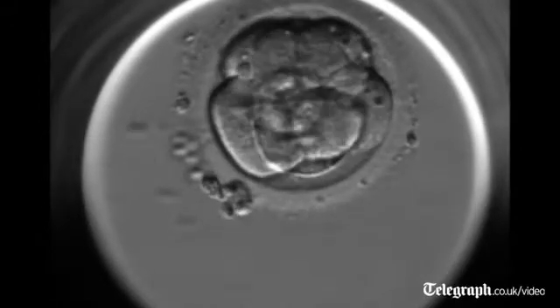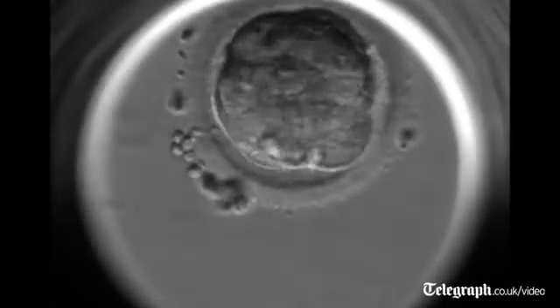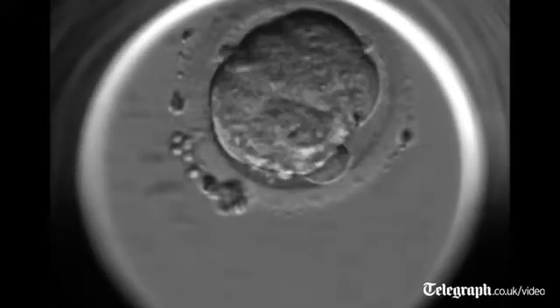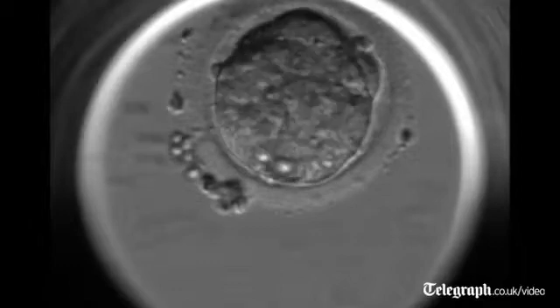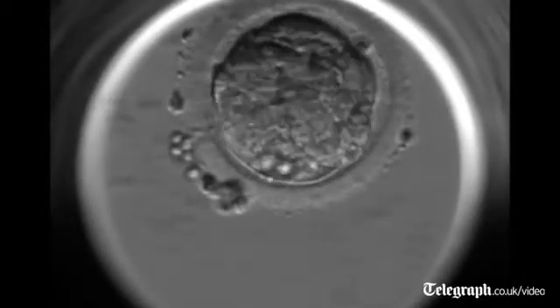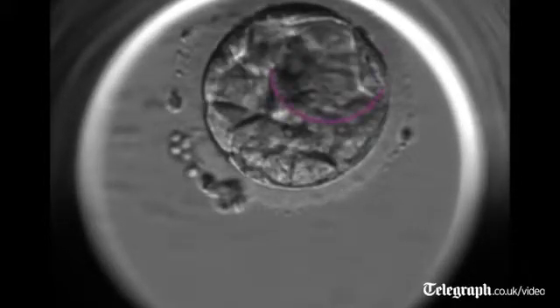So instead of over a 5-day period of culturing embryos where we'd normally get one look at the embryo per day, 5 images, we now have over 5,000 images over a 5-day period. We've done a lot of research and related this to babies that have been born to now tell us, quite extraordinarily, that the embryos that have chromosomal abnormalities will reach certain stages of development very differently to those that are chromosomally normal. So we can now look at these images without even touching the embryos. It's non-invasive, without even disturbing them, because it's in a closed system.